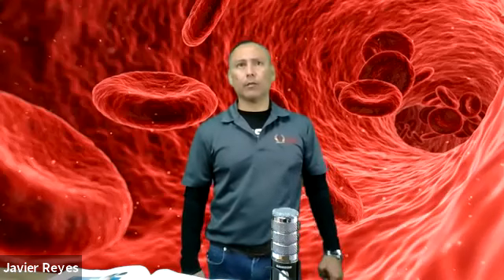All right. Coagulation studies cannot be done in capillary punctures because there's not enough plasma that can be taken out of the blood sample. You wouldn't have enough plasma to run the specimen in the machines. Blood cultures cannot be performed with capillary blood. That's just not enough blood to be able to grow enough bacteria in the bottle media. Tests that require large volumes of serum or plasma, obviously, again, cannot be performed by capillary puncture.